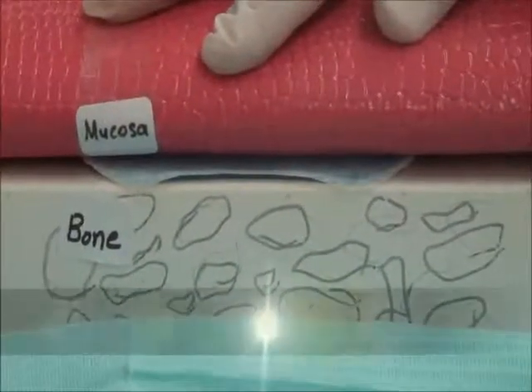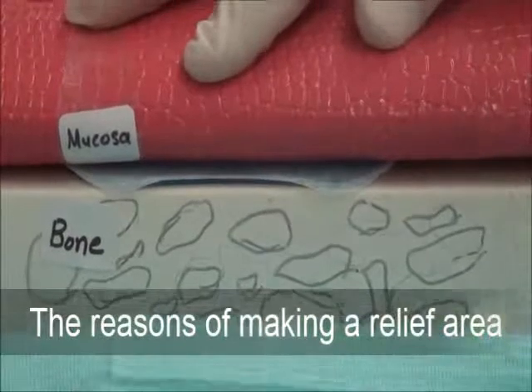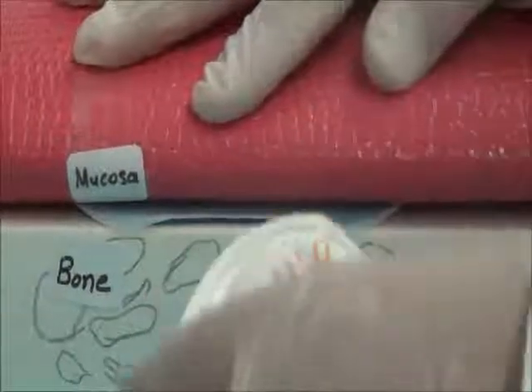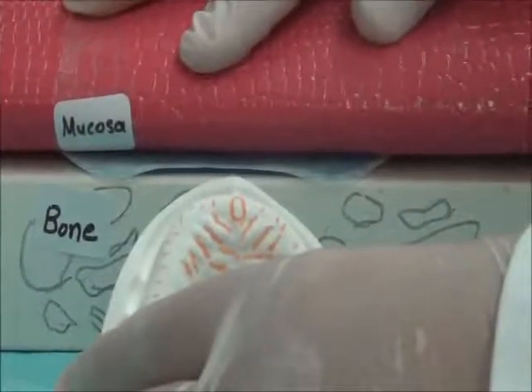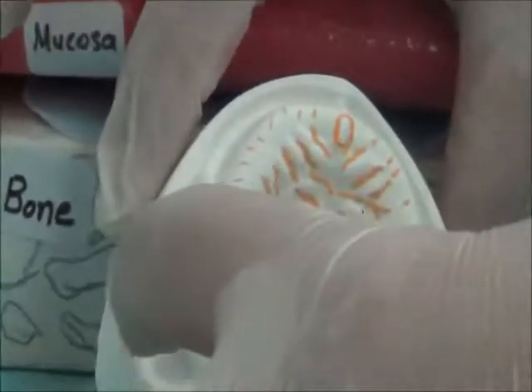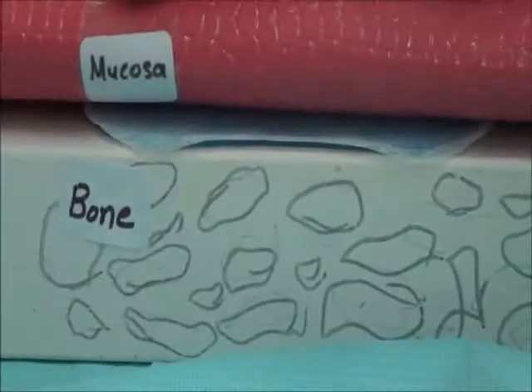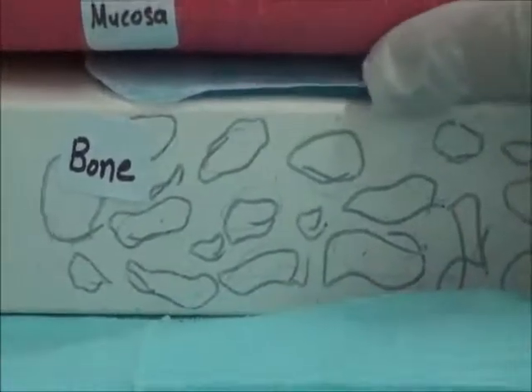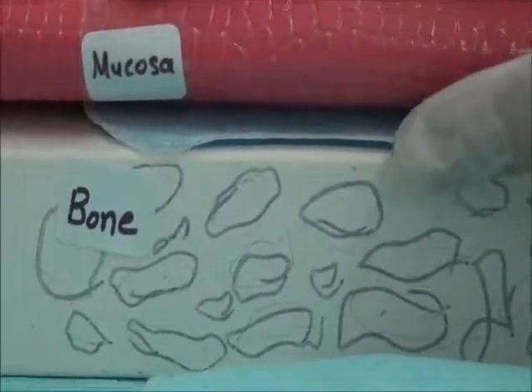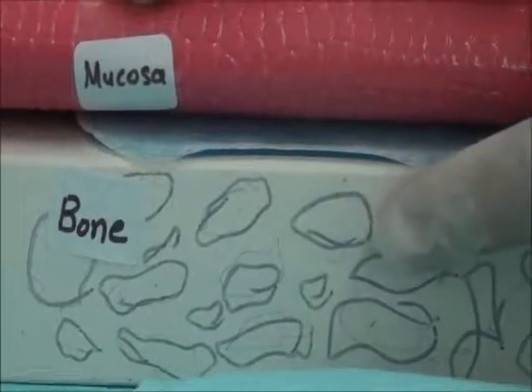Now we're going to review reasons why we need to relieve these areas using wax. The first reason is present in the following areas: around the tuberosities if they are bulbous, around undercut areas, and in the mid-palatine raphe area. This reason is that underneath the mucosa, the submucosal layer was not thick as the other areas we have shown earlier. It is a thin layer, and underneath it is hard bone.